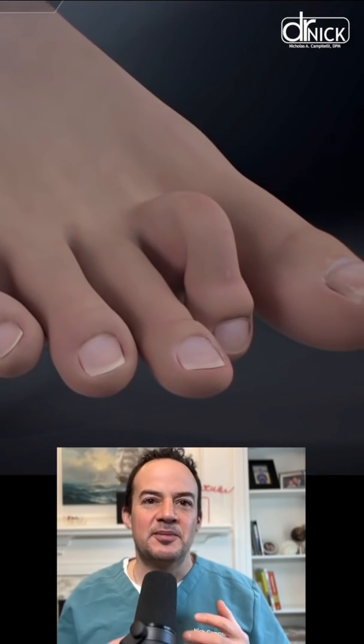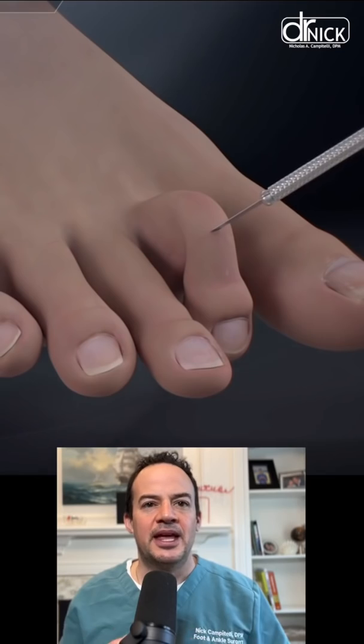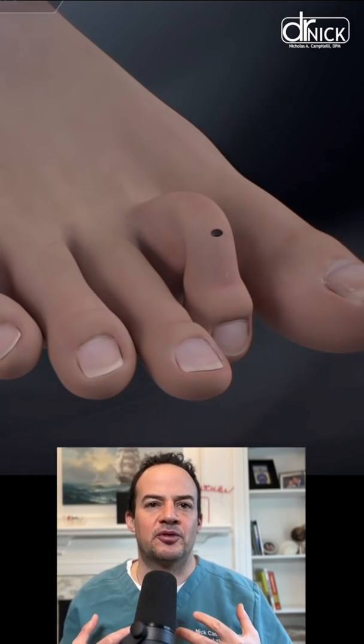Check out this video. This is a schematic of how we correct a hammer toe, developed by a procedure from a company known as Arthrex.